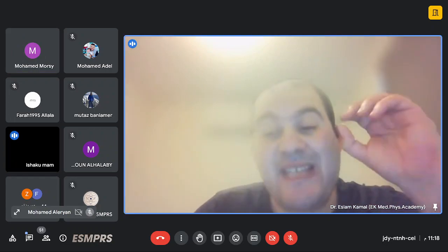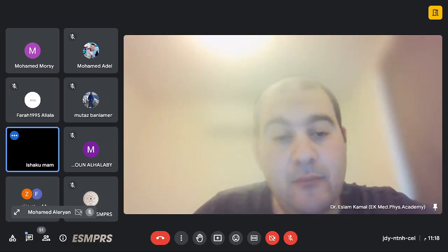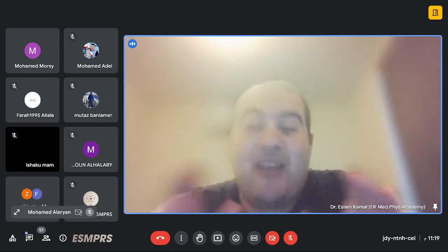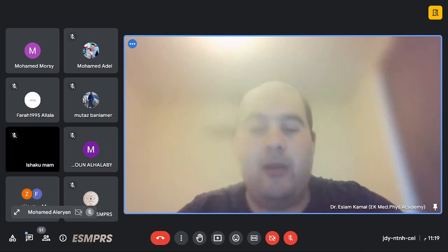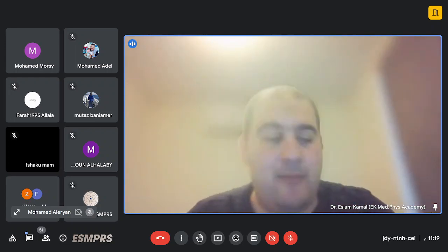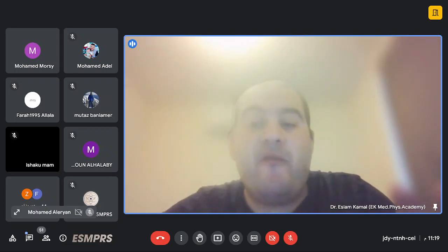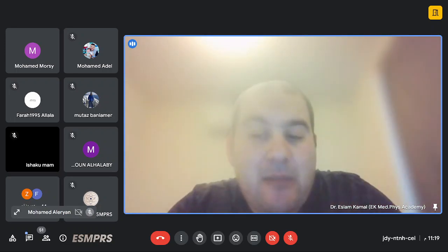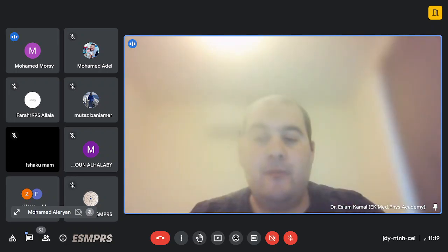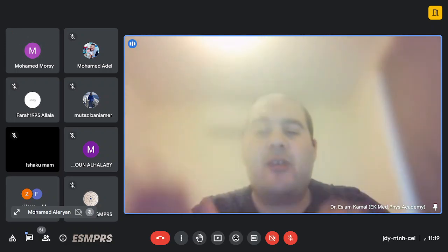فتبتدي انك تفكر في سيكونسز تبقى سيلكتيف، انك تقتل لي السيجنال بتاعت الفات، او تقتل السيجنال بتاعت الووتر، يعني تبقى متاكد ان التيشو بتاعك السيجنال اللي جاي لك من الفات منه نل زيرو. ده اداك مور كونتراست ومور داتا عن السيكونسات العاديه، صح كده؟ ده اللي انت بتعمله في الفلير والستير. في الستير انت بتعمل شورت تايم انفرجن ريكفري سيكونس، انت بتدي ار اف بالس ال 180 وهم راجعين بتختار نقطه معينه اللي هي النال بوينت، بيبقى الفات فيها وصل للزيرو. فانت كده متاكد مليون في الميه ان الفات بتاعك لو موجود مش هيظهر، مديك طريق دارك سيجنال.